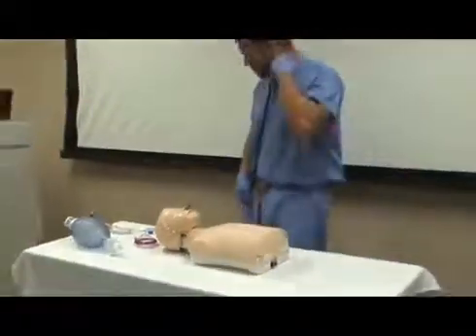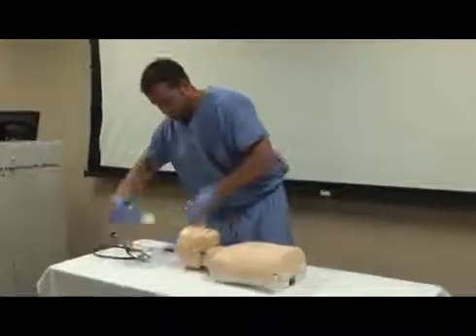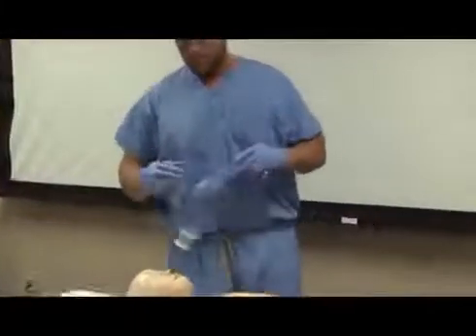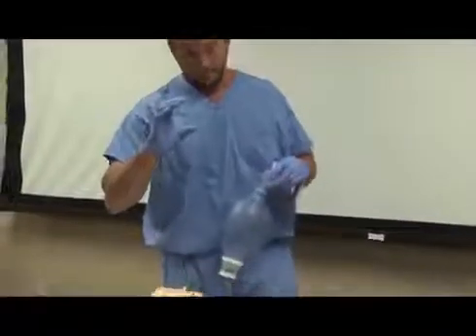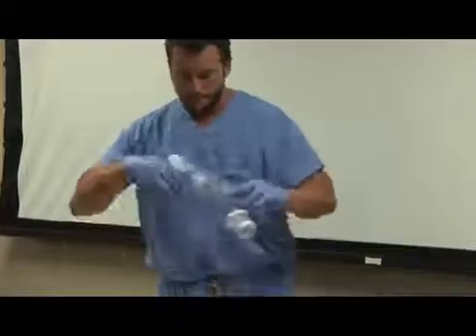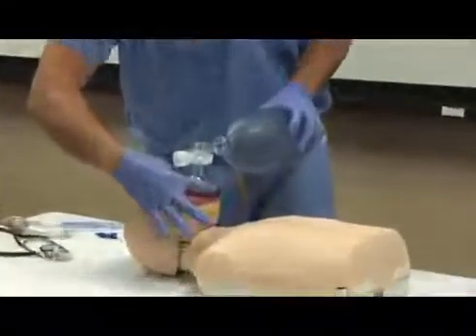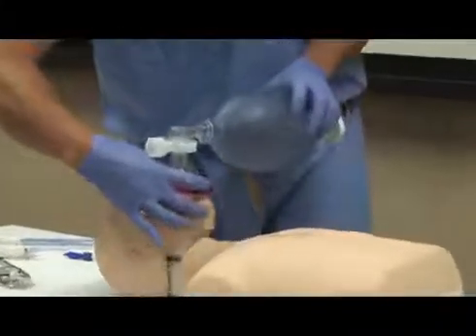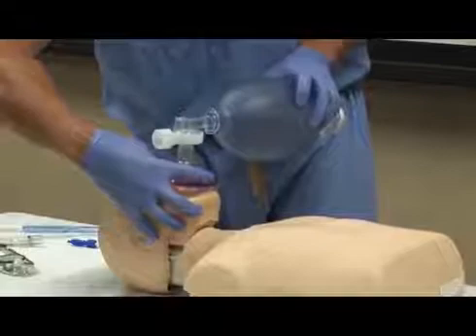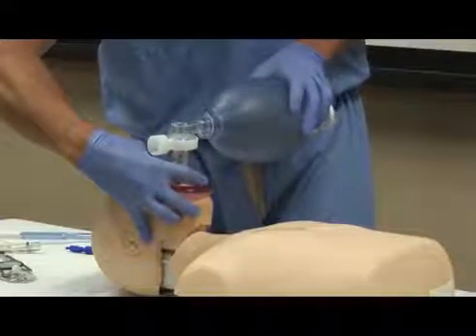To properly use the bag mask, use the EC formation with your hands. Form a C with the index finger and thumb of one hand on the top of the mask on the bridge of the nose. This securely applies the mask to the face. Now the three remaining fingers form an E, and use these fingers to lift the jaw, opening the airway.